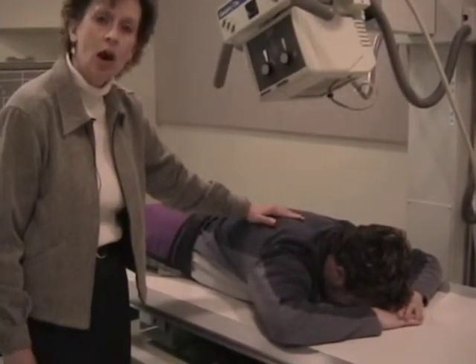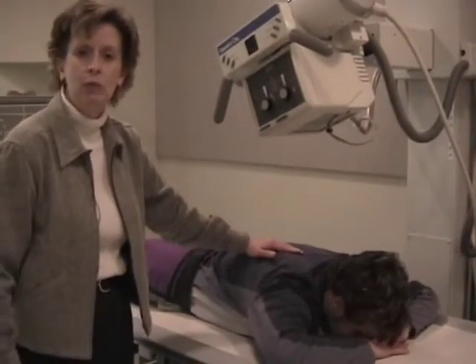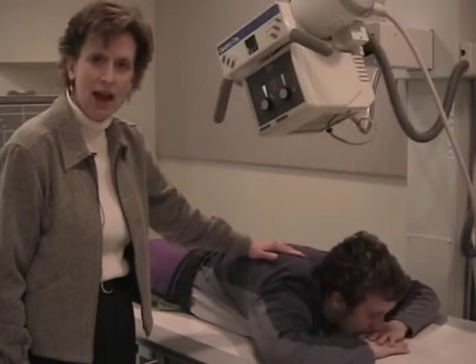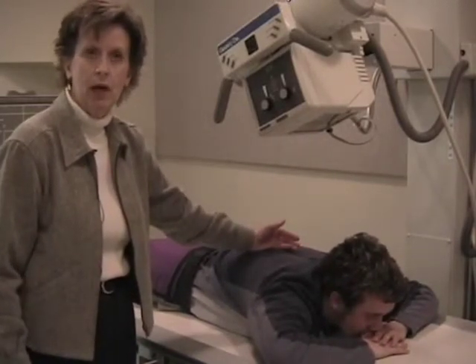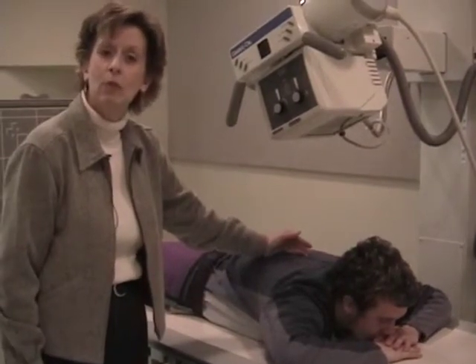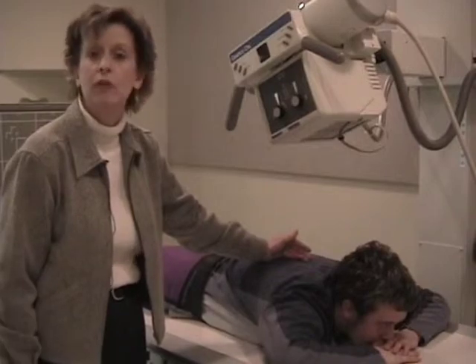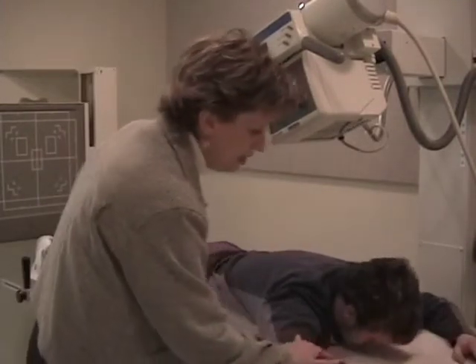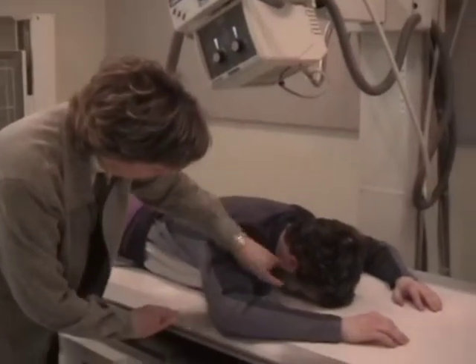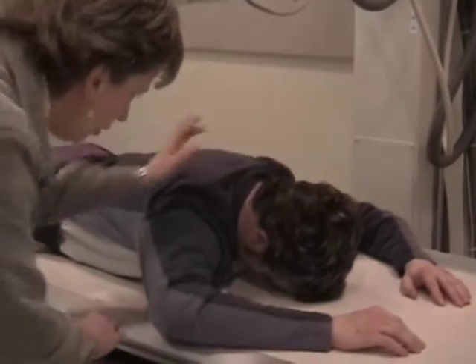So this is an alternate way to do a Towne. It would be referred to as a PA axial, and the gentleman that developed this position, his name was Haas. So refer to it as Haas or PA axial. Be prepared for either on a test. We're going to position the skull in a PA position. Recall that the orbital meatal line will be perpendicular. Patient needs to tuck his chin a little more.